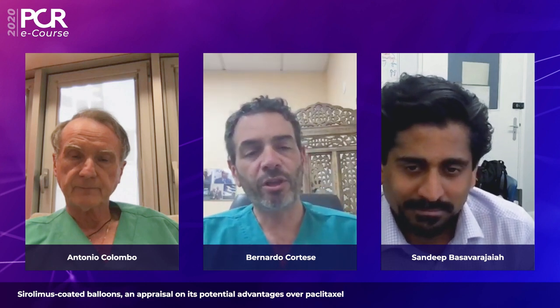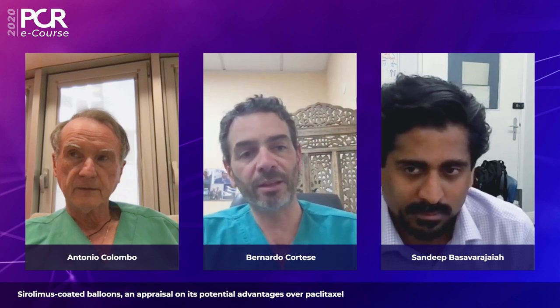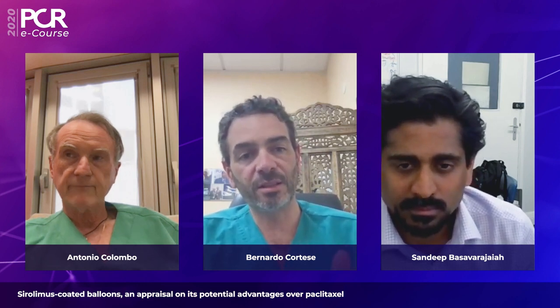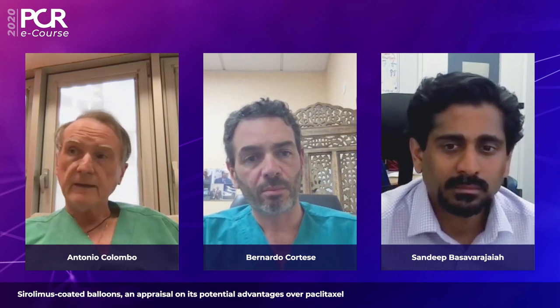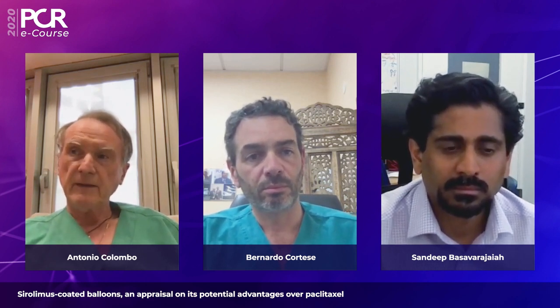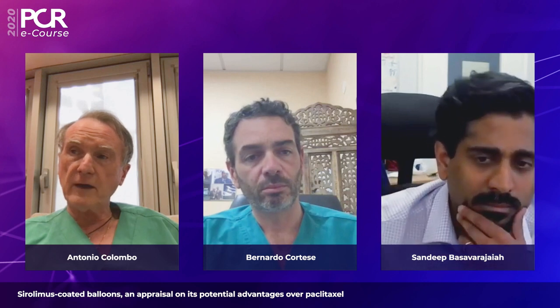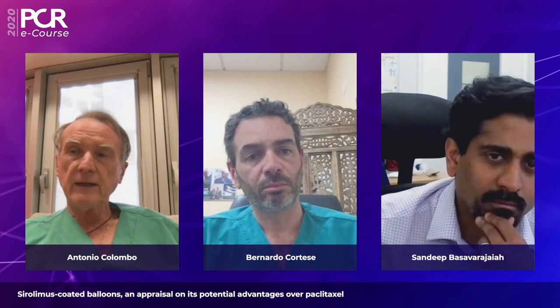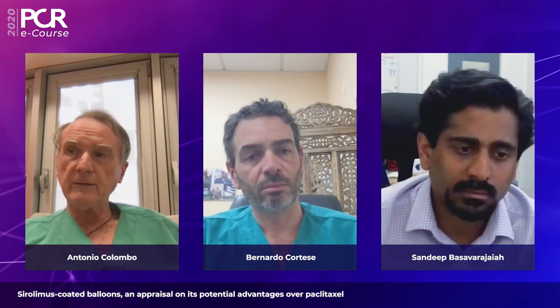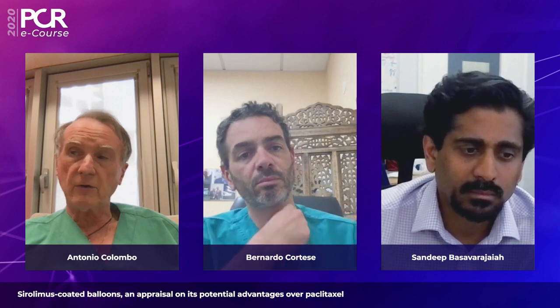And so what do you think? Do you think that the time has come to do a randomized study between a full metal jacket in multivessel disease and the short proximal stent and drug-coated balloon for the distal part of the lesions? I think so, especially long stents. I think when you have to implant a stent over 30 millimeter, I believe you can do randomization between drug-coated balloon and long stent.